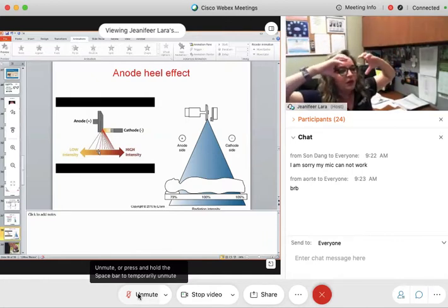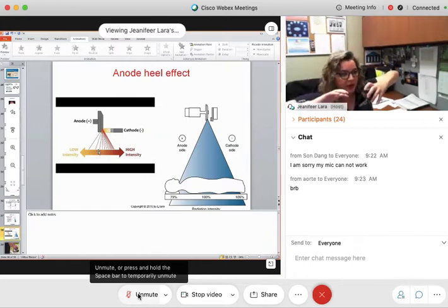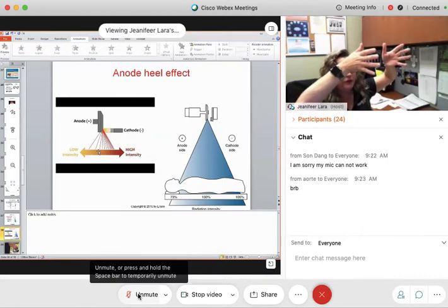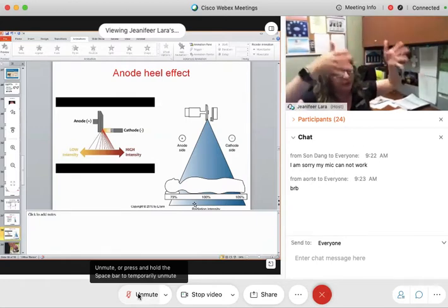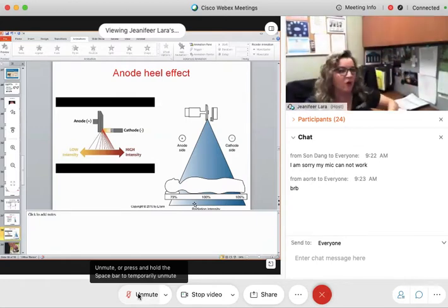If you have all of these X-rays at different energy levels and you lose a lot of them, then you're only left with so much energy. So chances are this energy is not going to be useful in thick, strong, or dense areas. It'll likely get more absorbed in the patient instead of going all the way through.